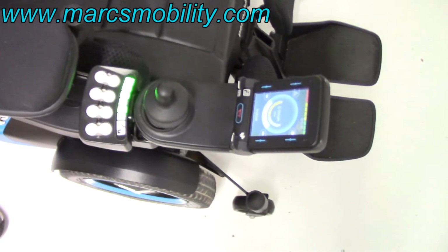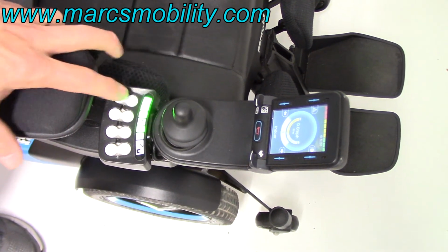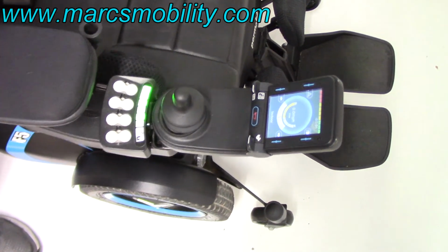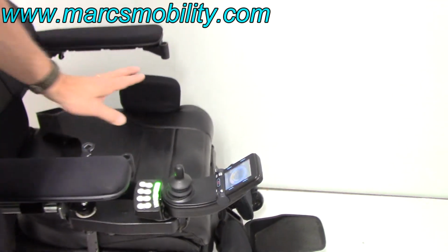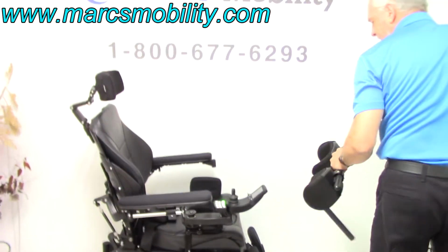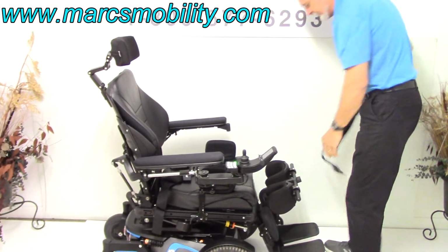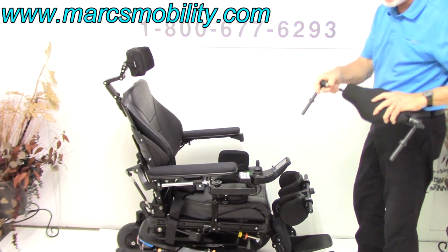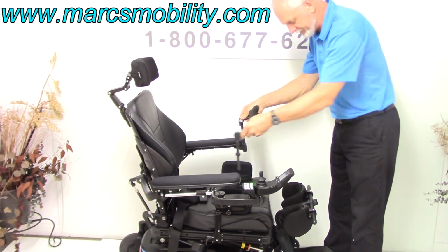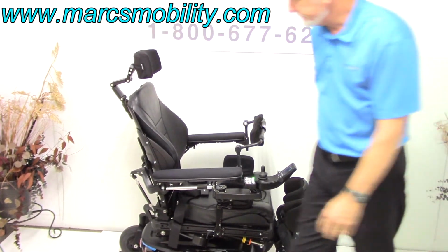So the first thing I'm going to do with this chair is go right to the standing feature. You can see where it says standing on the first button. Before you do the standing feature, first of all, you have to make sure the two things that you put your knee brace on. This is your knee brace. You have to make sure that that's in there. And the second thing, you want to make sure you have your chest strap because you don't want to be falling out. We wouldn't want that to happen. Put your chest guard there.